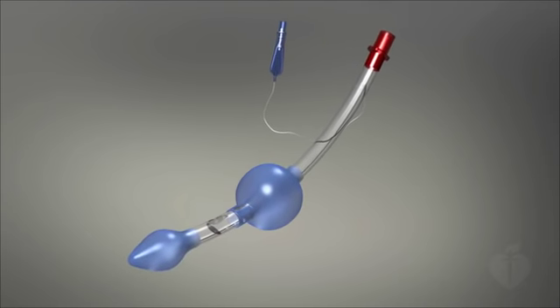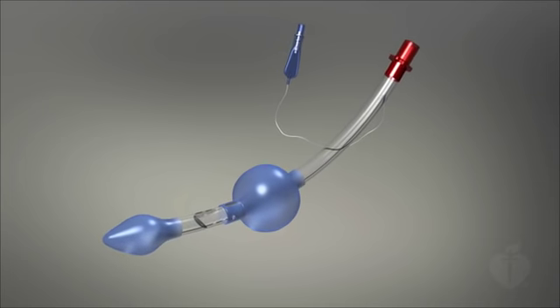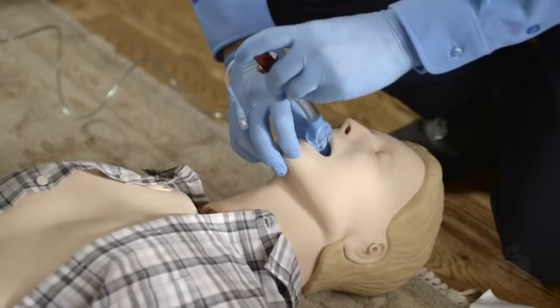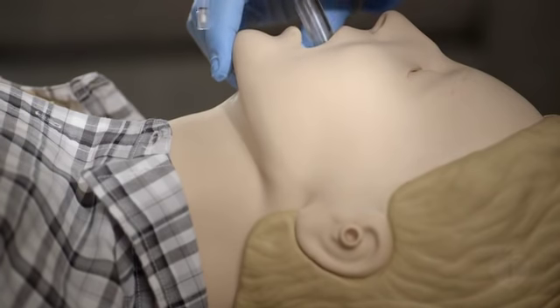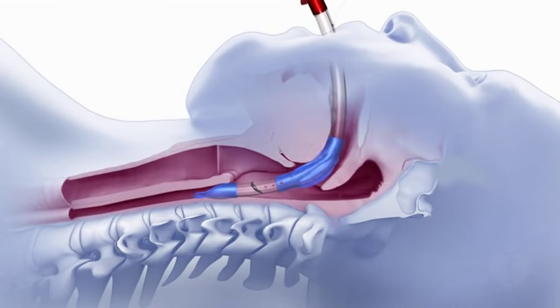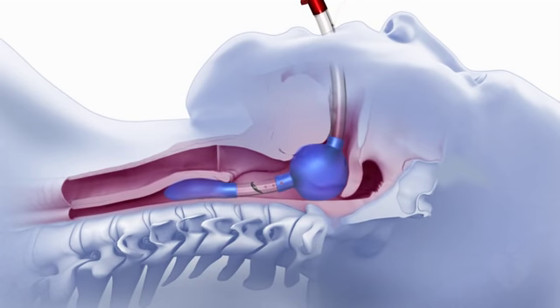The distal tip of the tube is angled and beveled to easily slide into a collapsed upper esophagus. The design also reduces the likelihood of tracheal insertion. When the tube enters the esophagus, you should feel resistance. Inflate the cuffs with a single syringe.